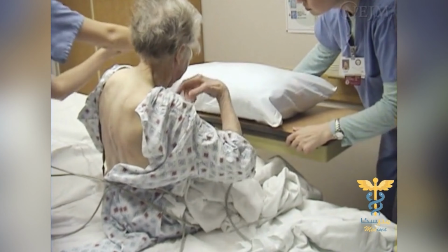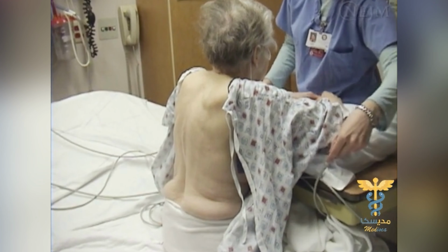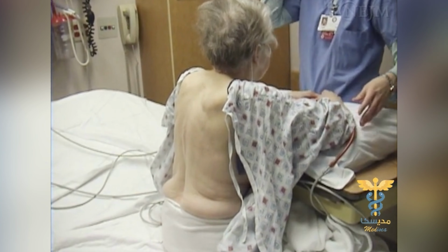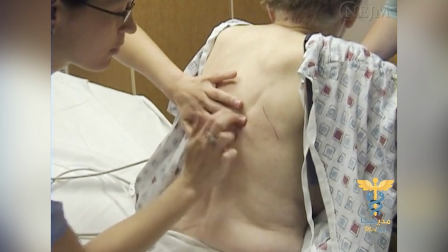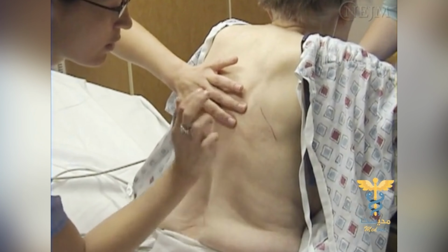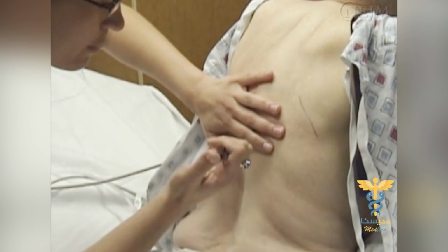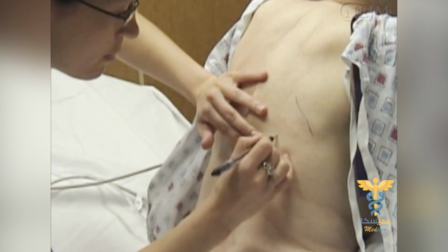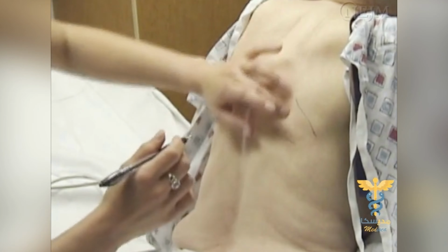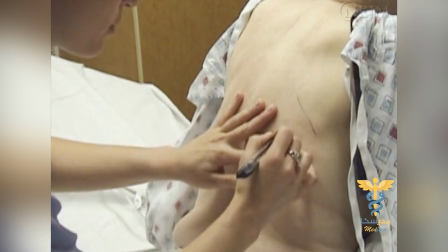You will need an assistant to help position and monitor the patient and assist with the collection of pleural fluid. Place the patient in a sitting position on the edge of the bed with his or her arms resting on a table. The height of the effusion is determined by auscultation and percussion of the posterior chest wall. With a skin marking pen, mark the needle insertion site. The site should be 5 to 10 centimeters lateral to the spine and at least 1 or 2 intercostal spaces below the top of the effusion. The needle should not be inserted below the 9th rib.